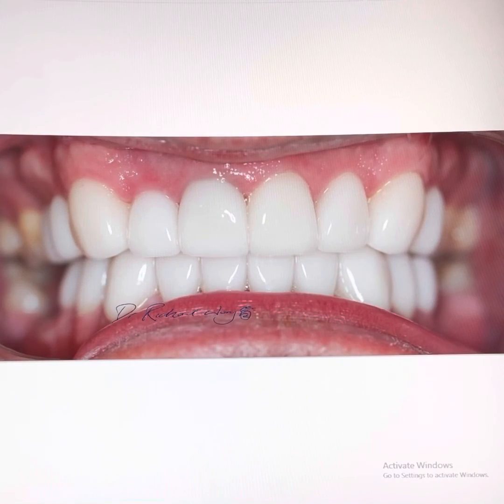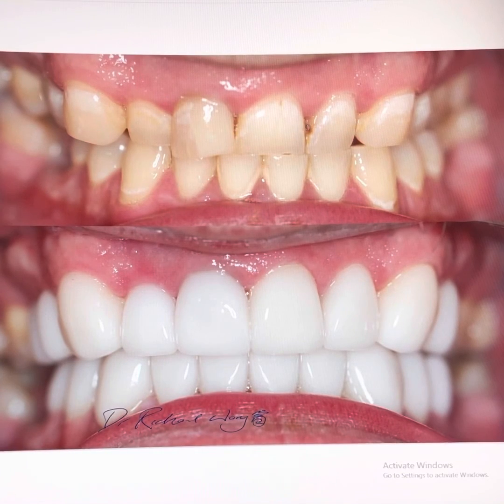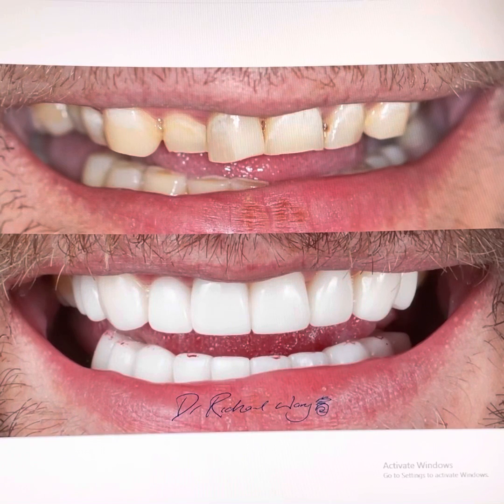We cement the lower crowns on. So we go from this, to this — 20 crowns, porcelain glass ceramic material — taking note that I have maneuvered the lower jaw into a better position, thus aligning the midline of the upper and lower teeth to the best of my ability. And now the patient can smile again, smiling with confidence. Smile Makeover Volume 19 is complete.